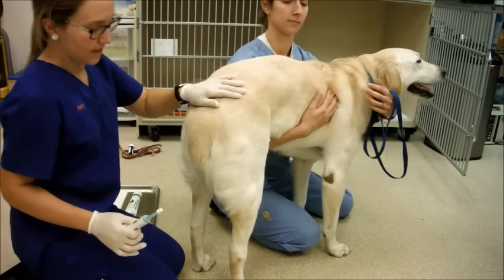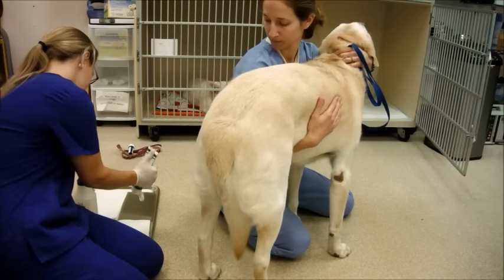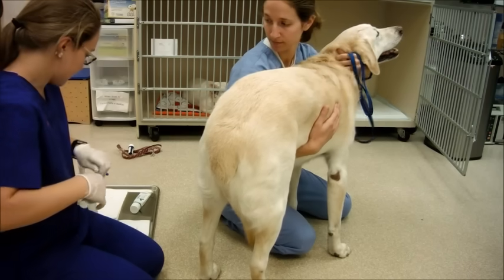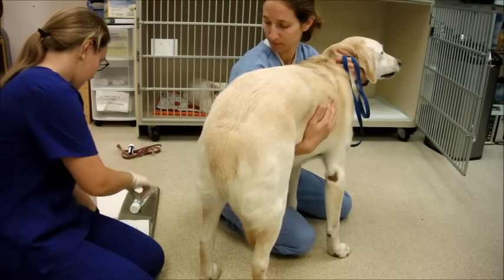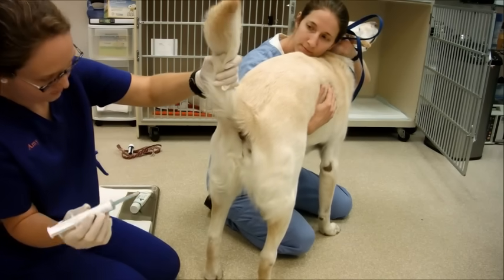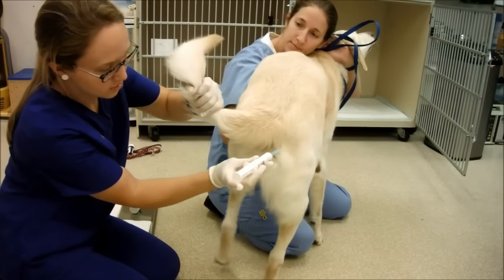I'm going to go ahead and get started as if I was actually going to do this. First, I'm going to squeeze out some of the lube onto a paper towel. If I were to actually give this to him, I would start by taking the cap off, dip it into the lube, and once I had it lubed, I would lift his tail. I would put it in about two to three inches into his rectum, and once I have it in there, I would go ahead and depress the plunger to give the solution.